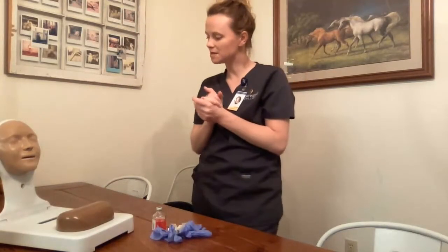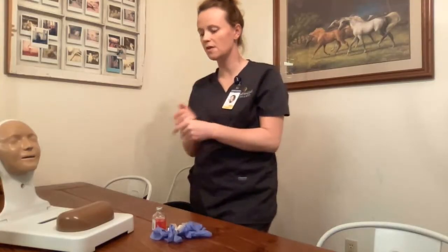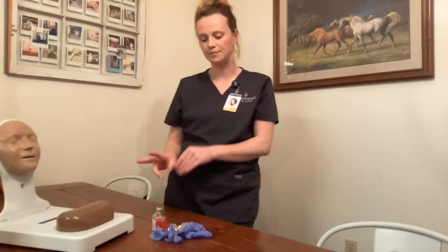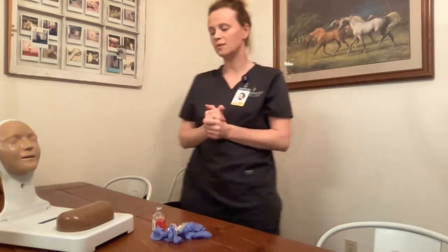Hi Mrs. Smith, my name is Emily. Can I please have your name and date of birth? I verify with their wristband — this gives me my two patient identifiers. That is correct. Do you have any allergies I need to be made aware of? No allergies? Okay.